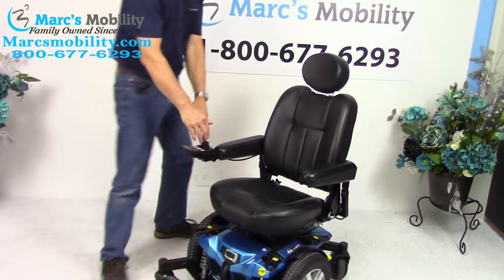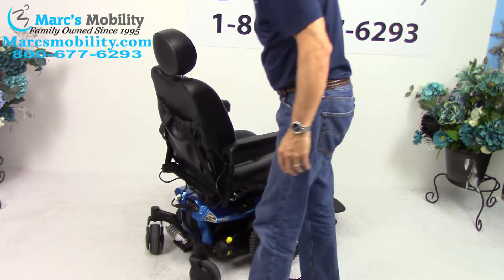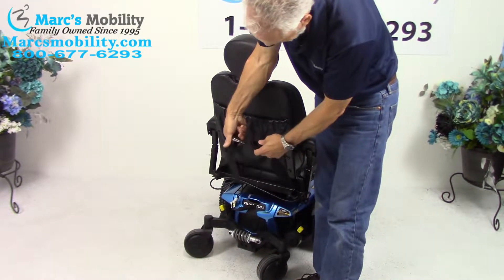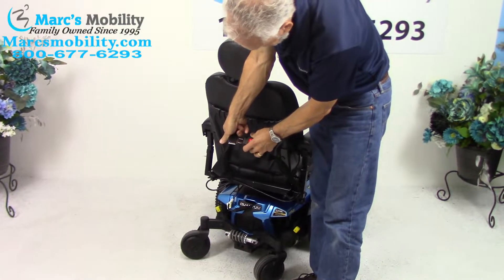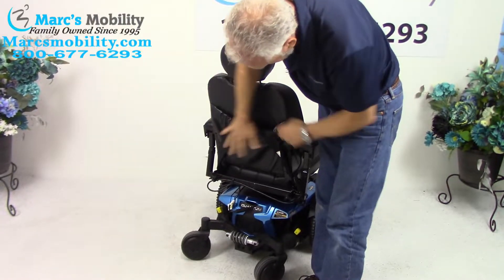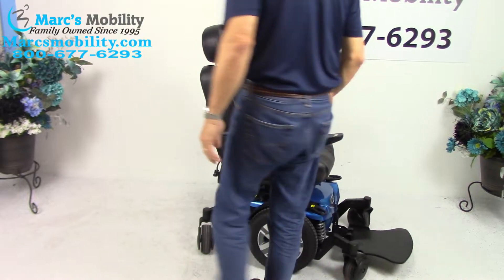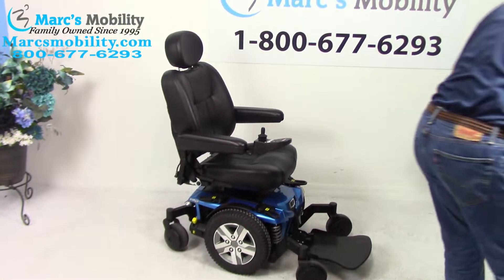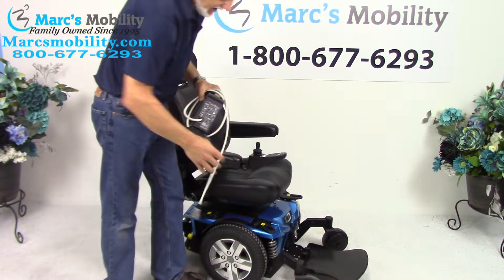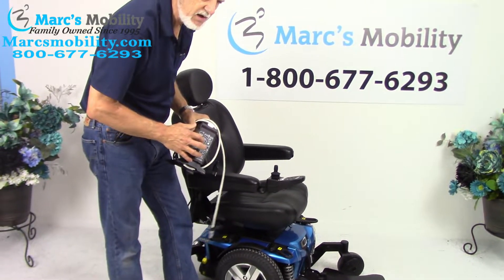As I said, this chair is very quiet and turns on its own length. Also back here you have your safety belt stored in the back pocket. When you charge this chair, you'll take your Quantum charger and plug it right below the joystick. As soon as the light goes from orange to green, it'll stop charging.